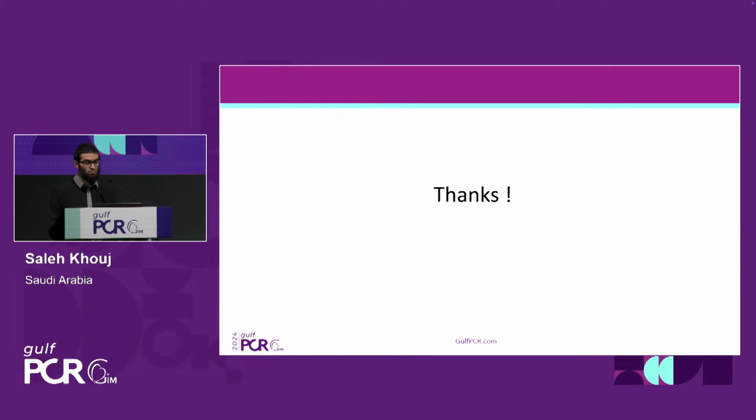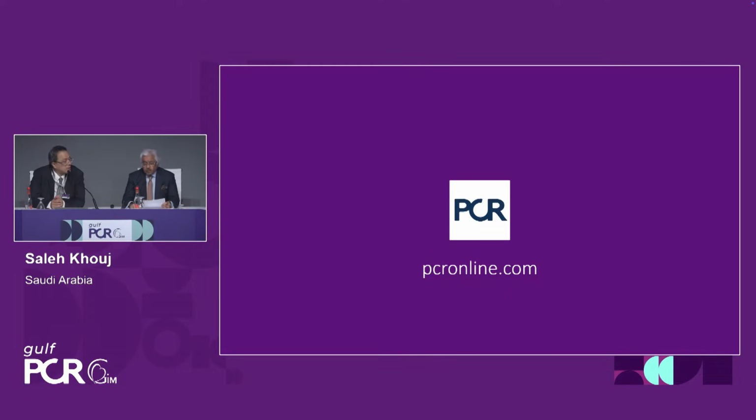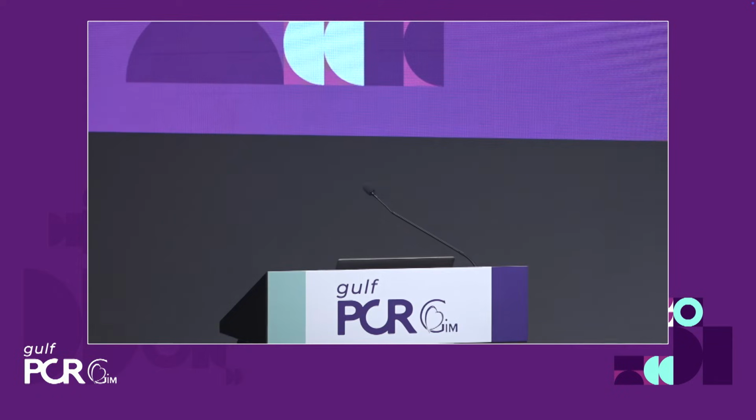Thank you, Saleh. That was wonderful. That was quite clear. Let's have a discussion around the table. We've got a large patient and a small valve. Andreas, there is great interest in small annulus recently, especially with trials being done specifically for this. What's your choice of valve in a small annulus?